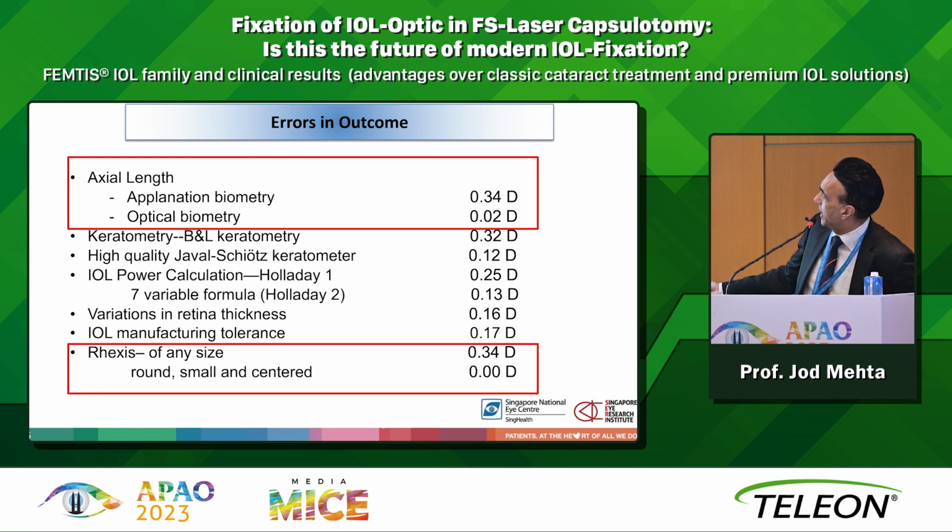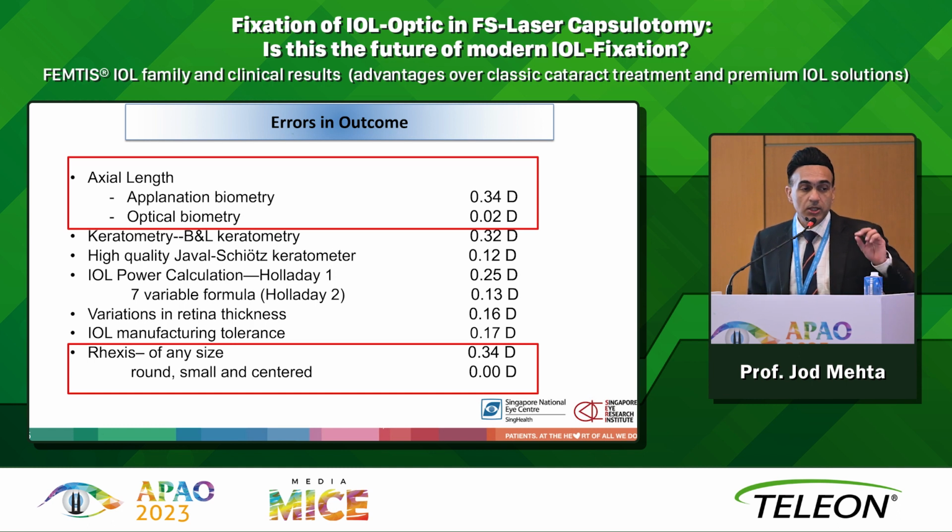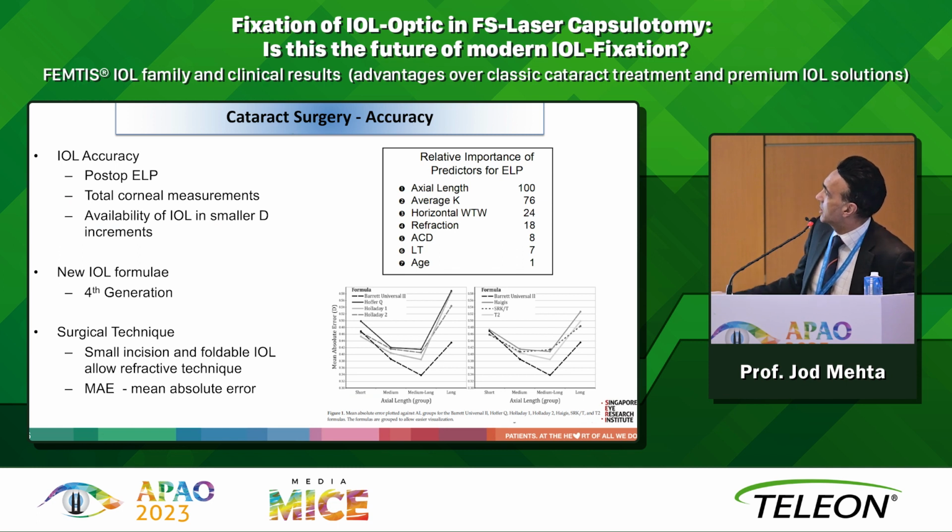So if you look at the other big area, this leaves your IOL calculation, where you have the largest area of inaccuracies. With respect to IOL inaccuracies, what we're all concerned about and try to improve is our effective lens position. So if you can predict your effective lens position after surgery, you're going to know exactly how to calculate your biometry. And there are lots of reasons which I'll show you why this is going to be difficult to do when we're putting lenses in the bags.